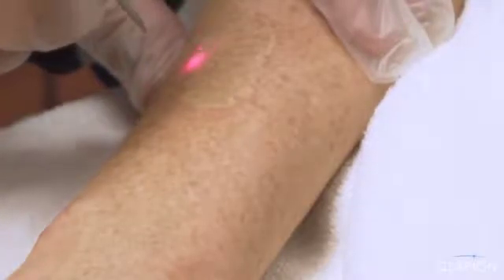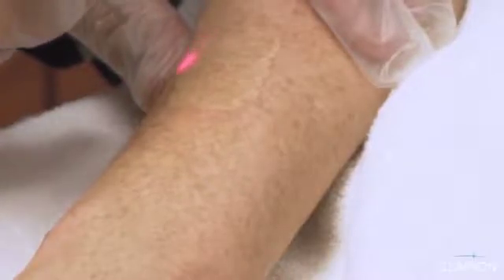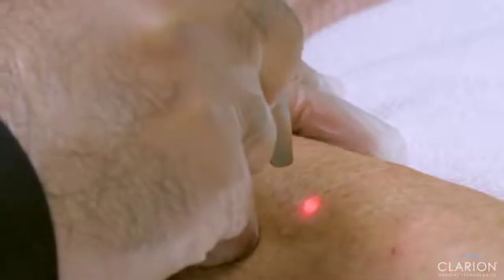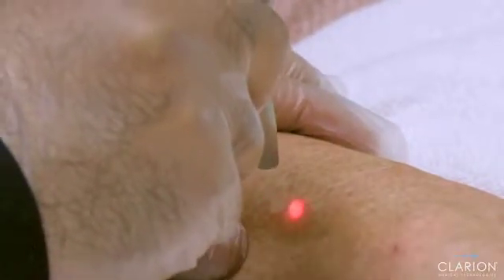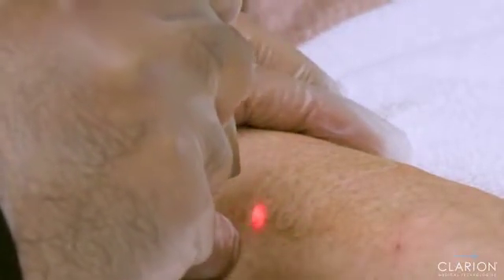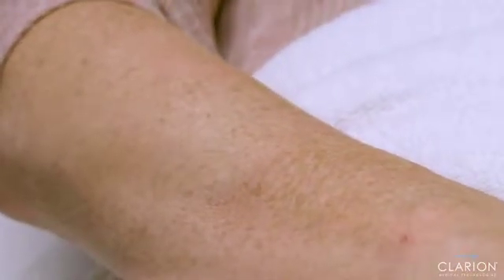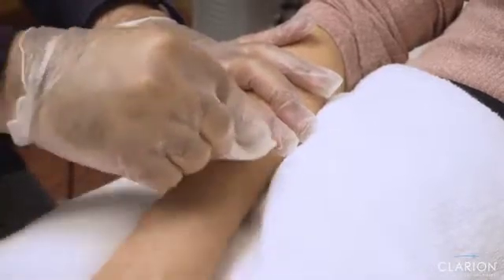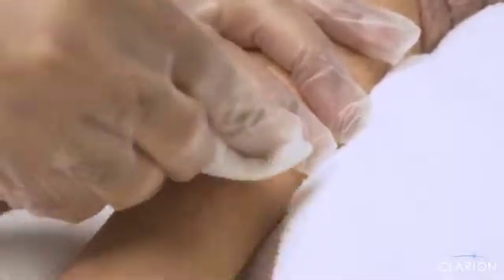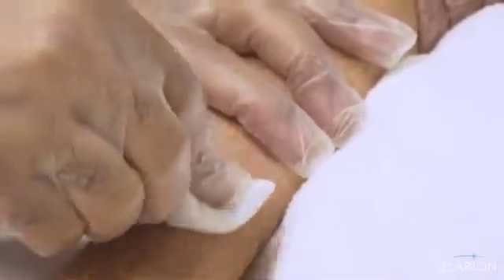How are you doing with the pain? It's a little bit more sensitive than the first time, but not bad. We should have applied the anesthesia. So this is the second pass, and you can see that in the area we treated, the pigmentation is much less. If we can do a third pass, then definitely it's going to show even more improvement.